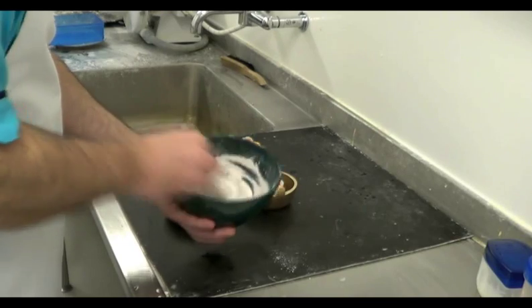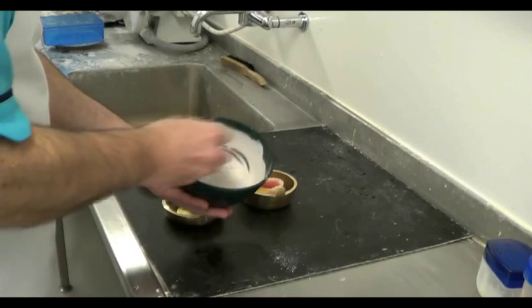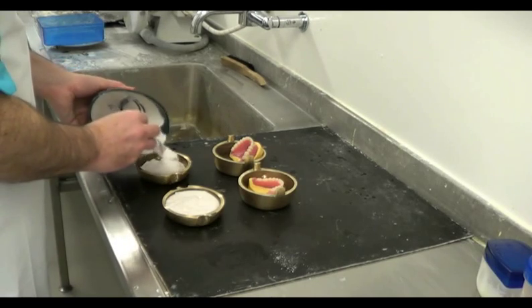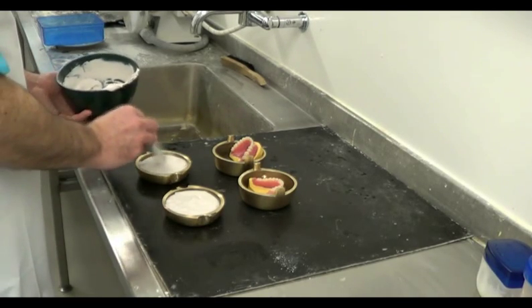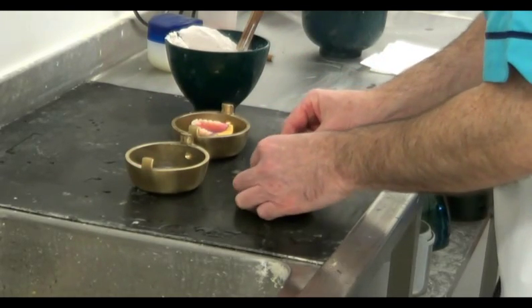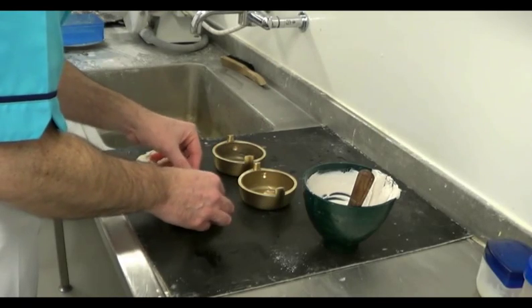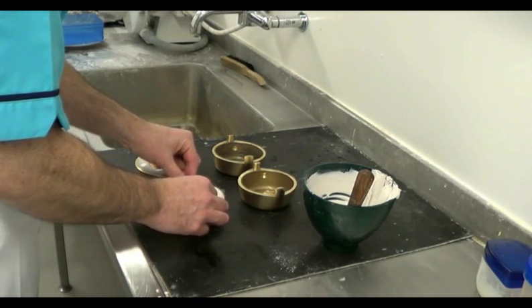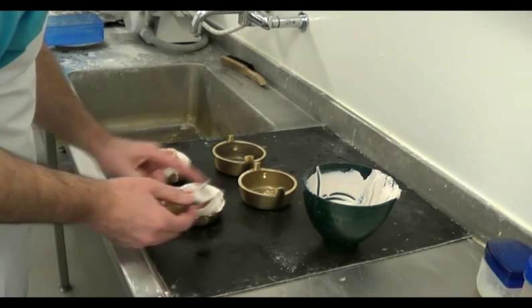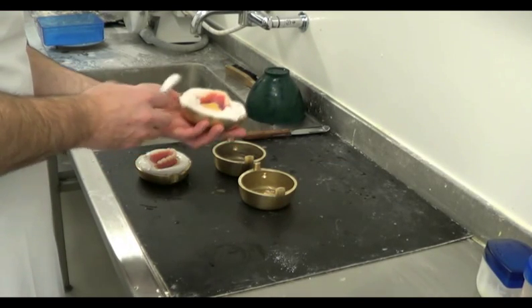We'll use a mixture of plaster of Paris to fill the lower portion of the denture flask. The denture models should be pushed down into the plaster, then smoothed until it is level with the edges of the flask and left to set.